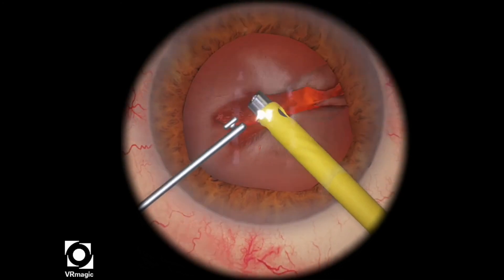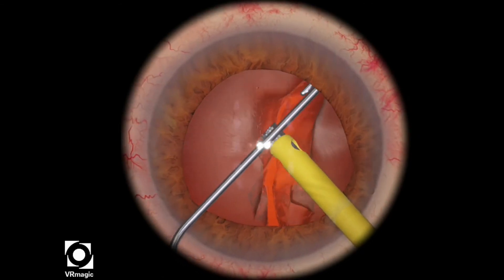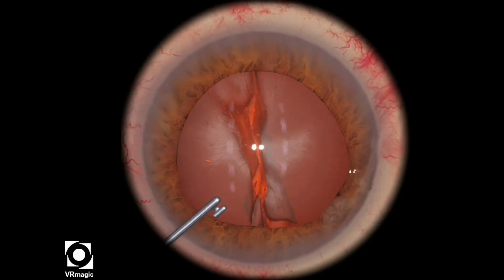So you need to finish the crack or propagate the crack. Just use your FACO tip to slowly move the material around. Dig your instruments deep into the trench, and then pull, and then you've created a crack.